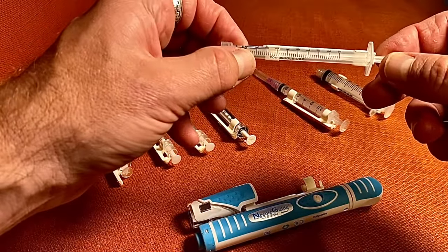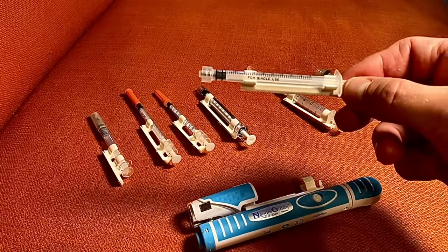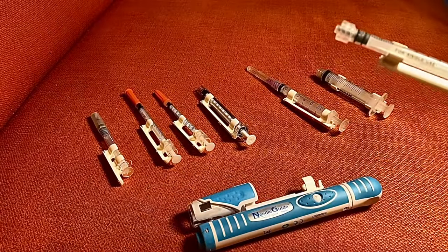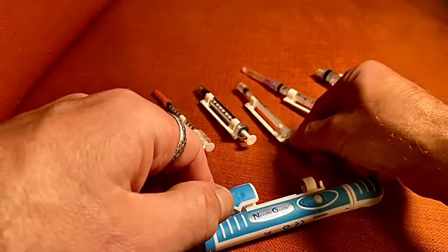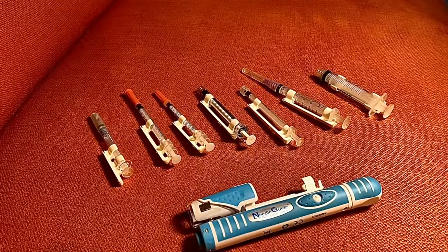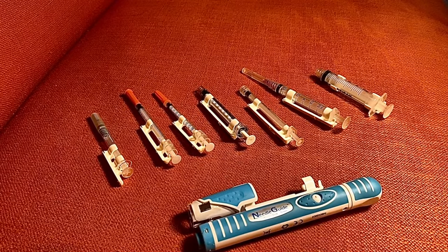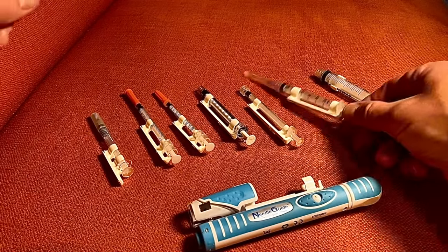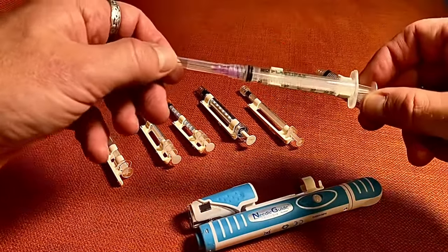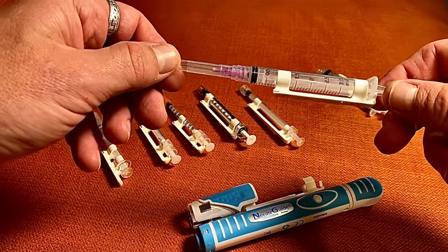This is probably the most common luer lock type syringe you'll find. The reason it's the most common is that they are very cheap. Most people use these, and we use them in the clinic as well. We give hundreds and hundreds of injections in clinic and they still work really well. We like the luer lock because of the ease of interchanging different types of needles.